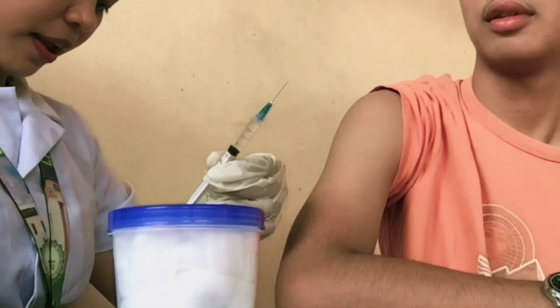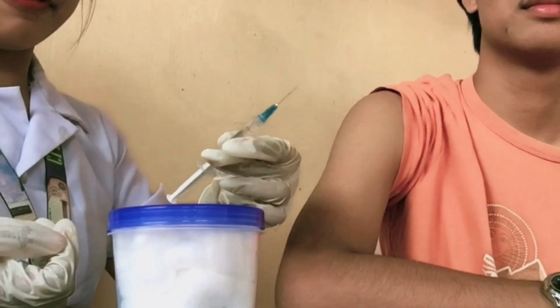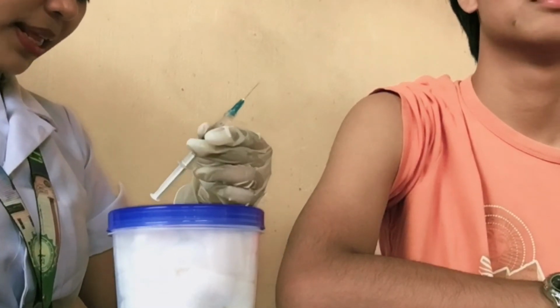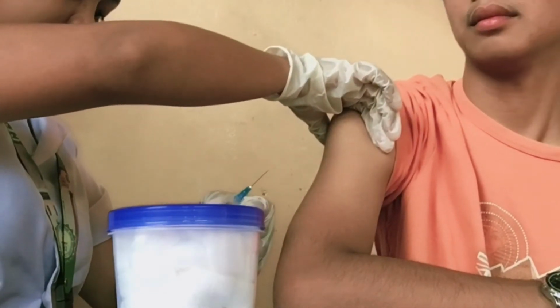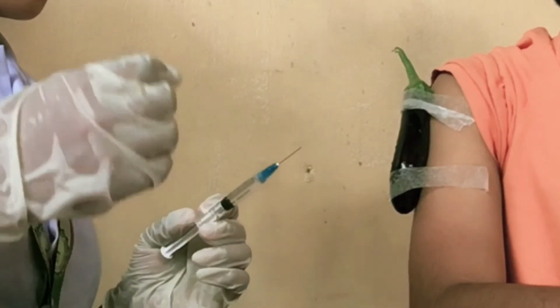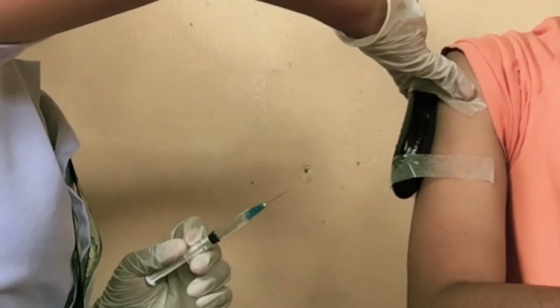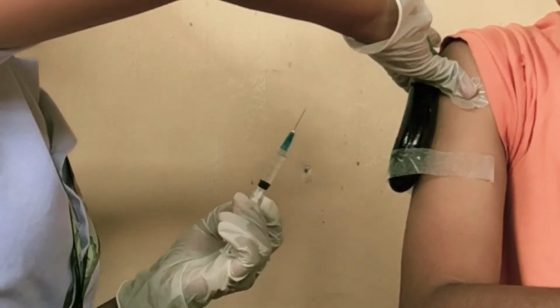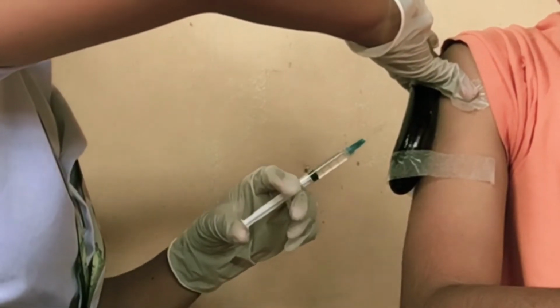We need to grasp the syringe with my dominant hand between my thumb and fingers. Next, we place my non-dominant hand on the arm of the patient and pinch the site where we'll be injecting the medication. I need to insert the needle at approximately 45 degrees, and we need to make sure that the bevel is up. Then carefully and firmly inject the medication.